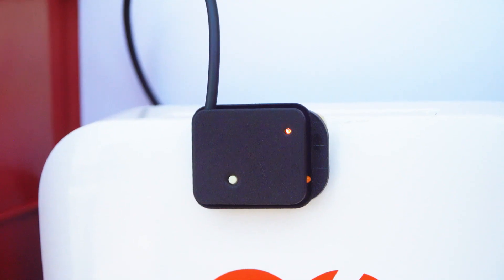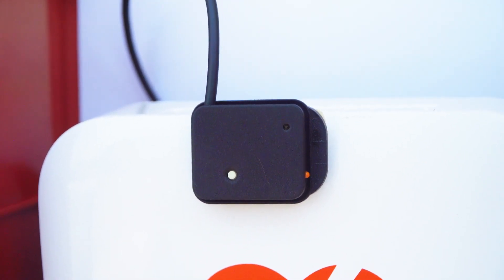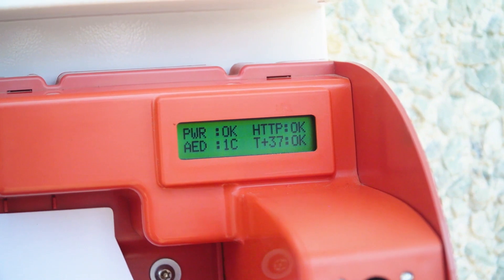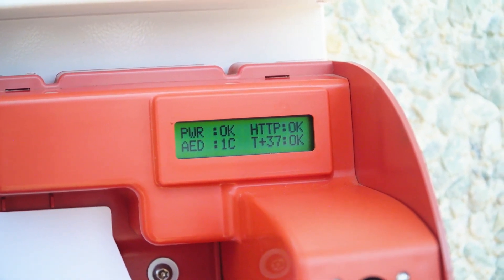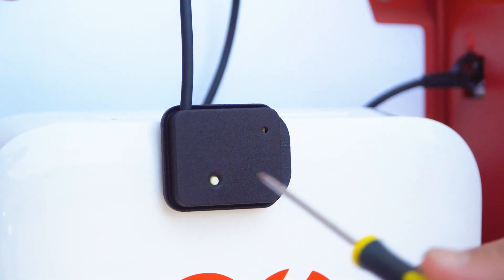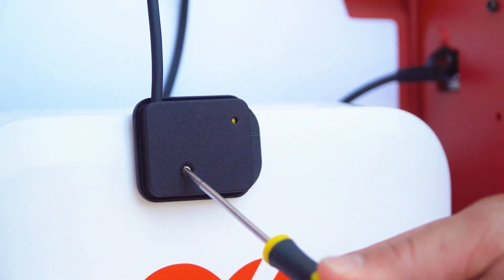In a situation where the AED has been changed to a different model, the sensor may require calibration. This is represented by a 1C in the AED field of the LCD screen. To calibrate the sensor, simply push the white button on the optical sensor.